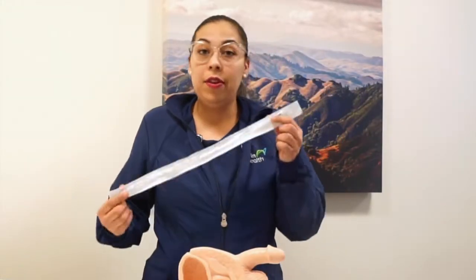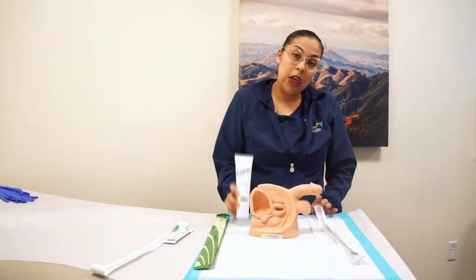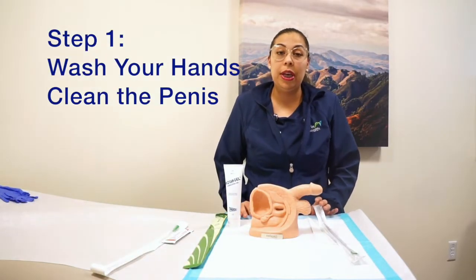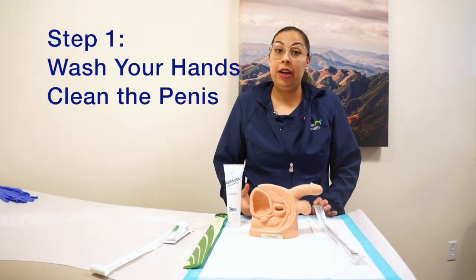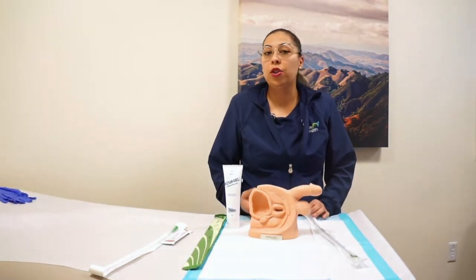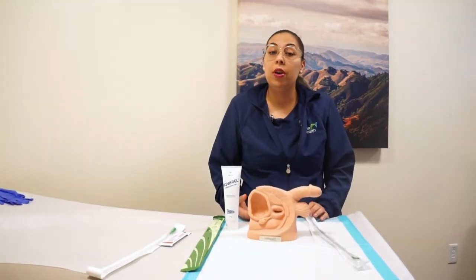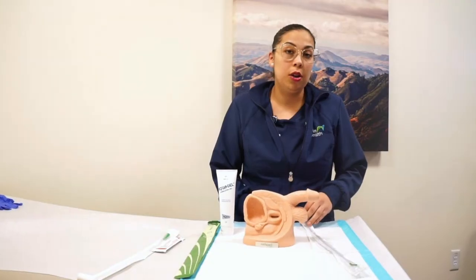So I have my catheter here. We have two types of catheter. This one is not lubricated, so you're going to have to use gel for lubrication. It's a water-based one. When you're ready to do the self-catheterization, as your doctor prescribes — like doing two times a day or three times a day — it depends on your provider.